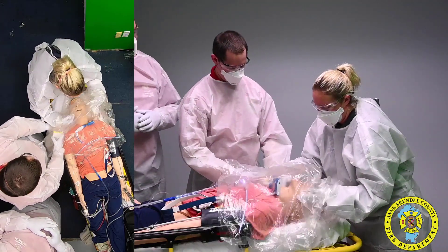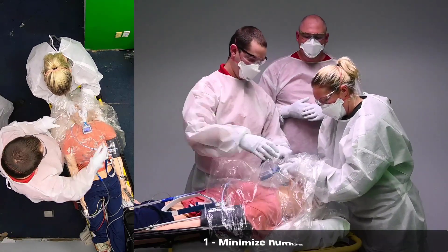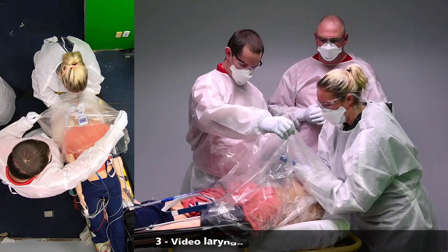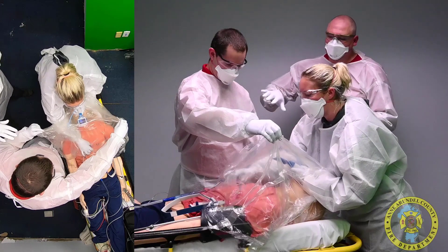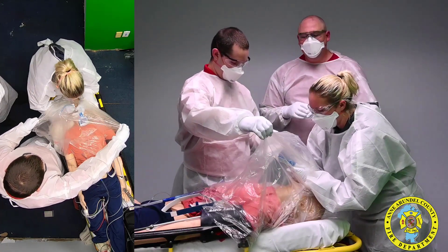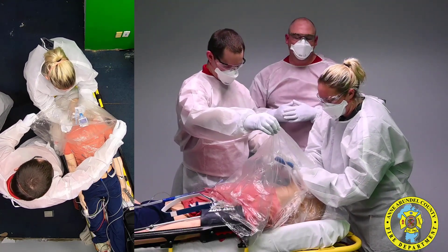She is going to put her hands through the arm holes of the poncho to gain access to her equipment, placing the video laryngoscopy device and visualizing the airway, passing the bougie for first-time ET success. Our second clinician is lifting the poncho — we call that tenting the poncho — which allows room for the devices going in and out of the airway, like the bougie, the ET tube, or the video laryngoscopy device.